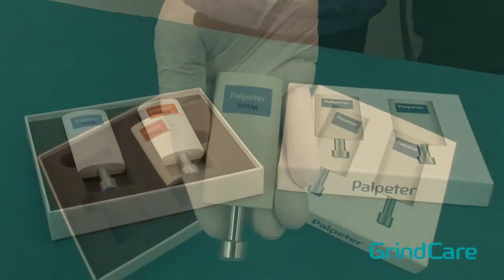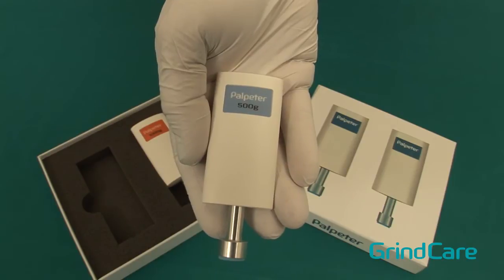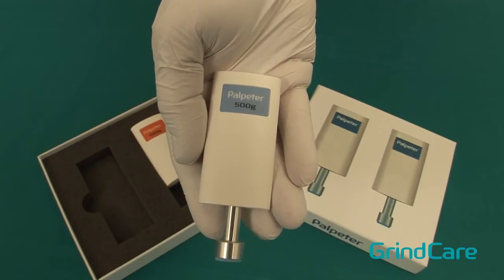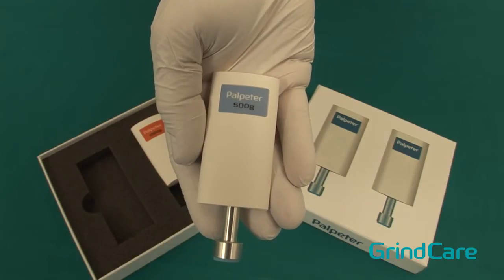The 500 gram, or 1 pound of pressure version, is used for palpation of the posterior mandibular region, the submandibular region, and the temporomandibular joint.